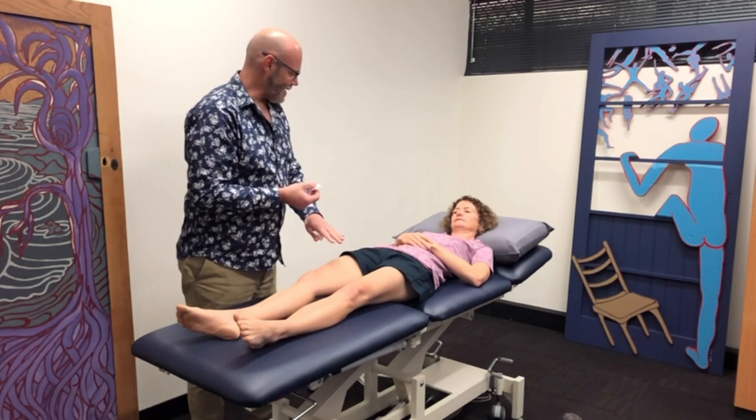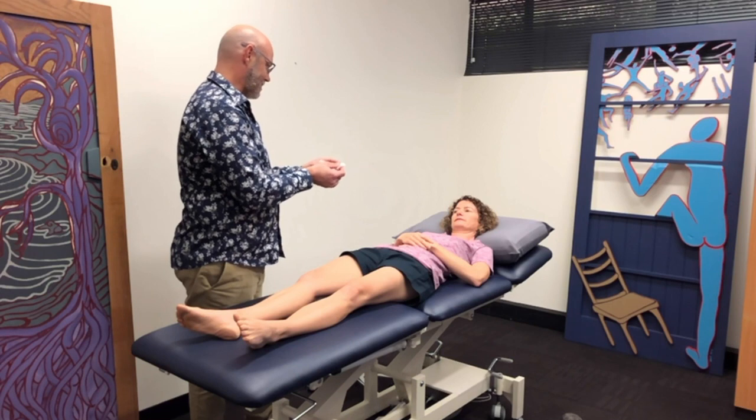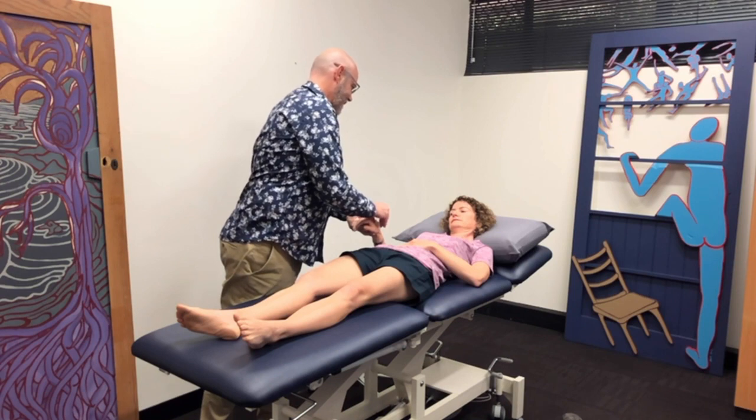Okay Jenny, is that settled back down after that last bit of testing? Yes, okay. So now we're going to try your response to cold. I just want to try this on your hand first. Are you feeling that?